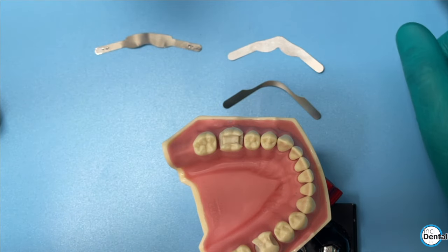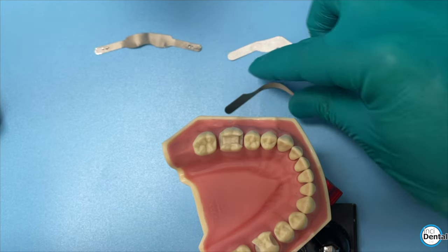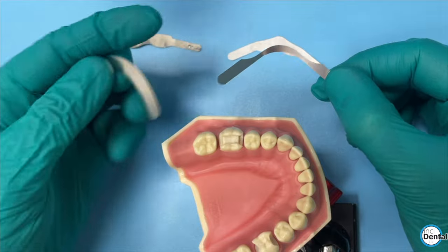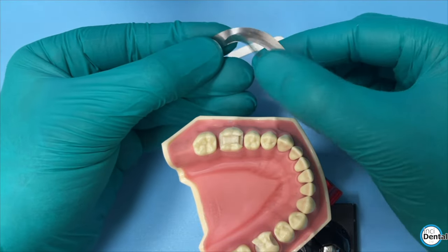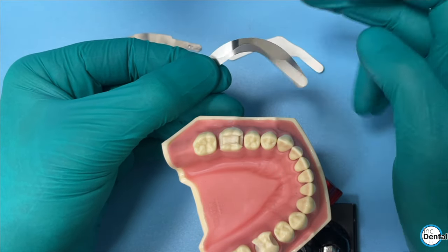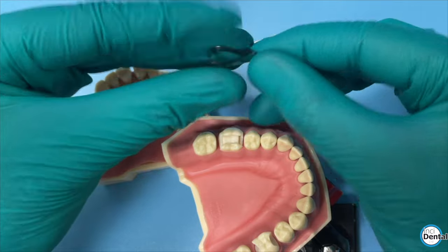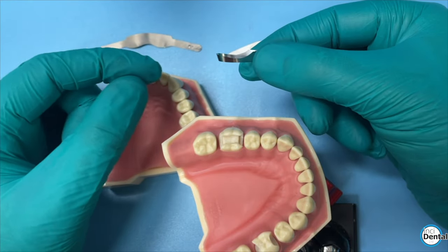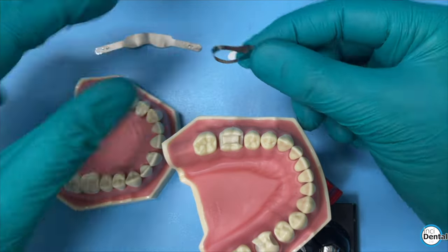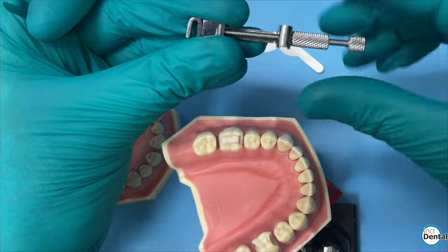The next innovation is this thinner band. You may have seen these deep margin elevation bands and wondered what is going on. A DME band is basically a standard U band that's been cut thinner in the middle portion. When you fold the band over, you still get that really nice steep emergence profile, but you have a much thinner band. This was popularized by dentist Pascal Manier when he talks about deep margin elevations - there's a published technique with this thinner band.